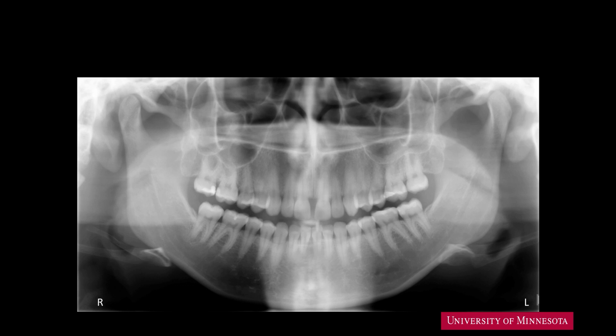Make sure that your radiograph is properly mounted on the view box or your computer screen. All panoramic radiographs will have a marker indicating the left side by the letter L. Some units may have both right and left indicated with letters R and L. You will review the image with the patient's left side on the right side of the computer screen or view box. This is similar to the way you are talking to a patient face to face — your right side is the patient's left side.